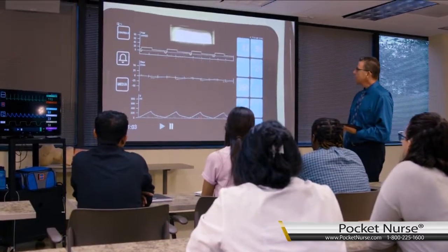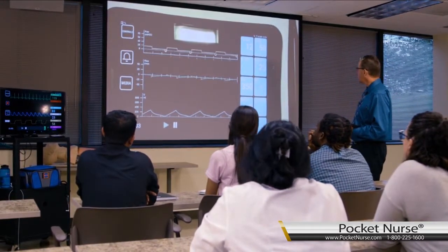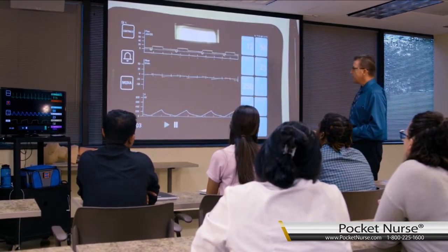What I really liked about the questions were that they challenged me, and they really helped enforce clinical application of managing a patient on a ventilator. Okay, so you guys really want B? Yes. Final answer? Final answer. B. Okay, so we're going to apply B, and here's your patient now on the BiPAP, 12/6, with 50% FiO2.